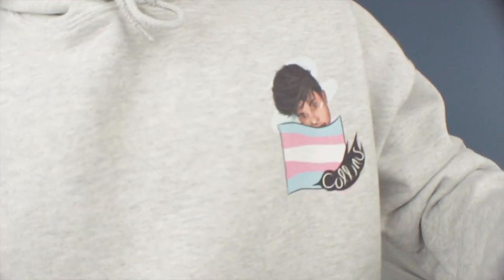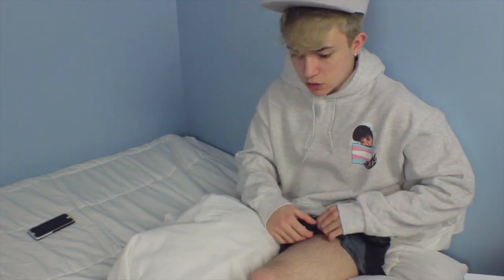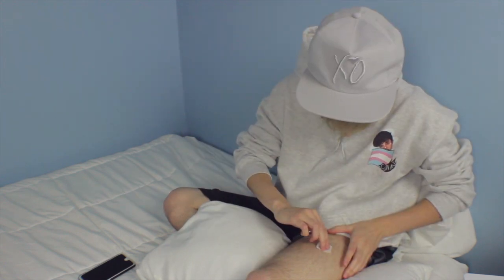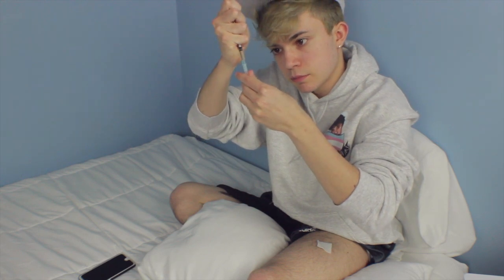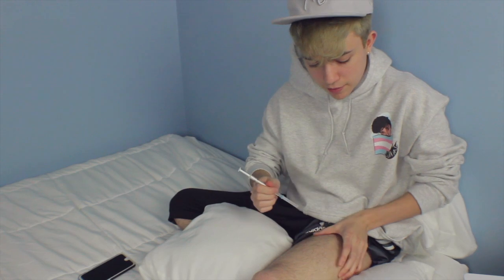I'm going to change the angle so you guys can see me do this. For those that are curious — does it hurt? I would say 20% of the time. Usually 80% of the time you can't really feel anything. I do it in my upper thigh. I've been doing it for three and a half years, so I find this the most comfortable. I've done it in other places too, but I like the leg. So you take your alcohol pad, find the spot you want, and clean it. I always make sure I have all the air out, and I also grab the skin.